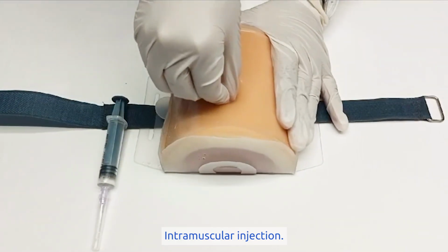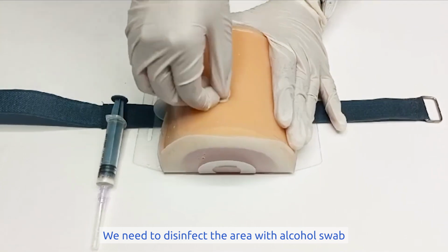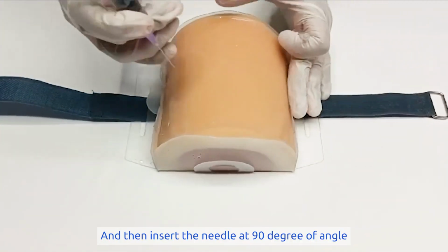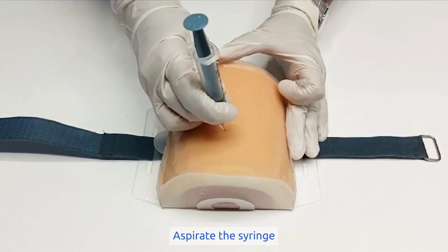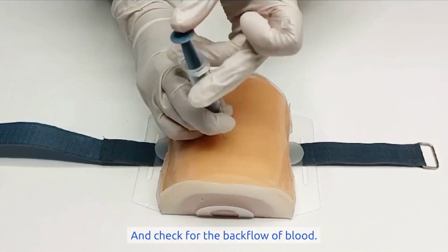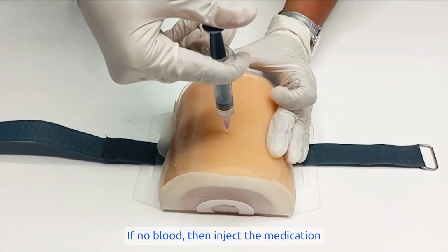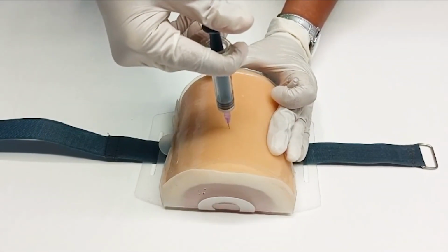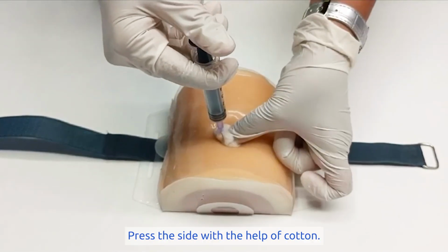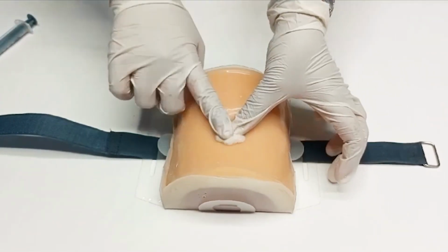Intramuscular injection: we need to disinfect the area with an alcohol swab and then insert the needle at a 90 degree angle. Aspirate the syringe and check for the backflow of blood. If no blood, then inject the medication and remove the needle. Press the site with the help of cotton.